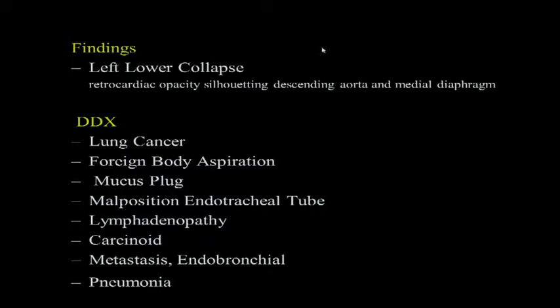Retrocardiac opacity, silhouetting the descending aorta and the medial diaphragm. Very important. It's a very benign finding. Oh, it's just atelectasis, what's the big deal? Well, it is a big deal because that can sometimes be the only finding in lung cancer, foreign body aspiration, mucus plugging, malpositioning of the endotracheal tube, lymphadenopathy causing tracheal compression, carcinoid, endobronchial metastases and pneumonia.